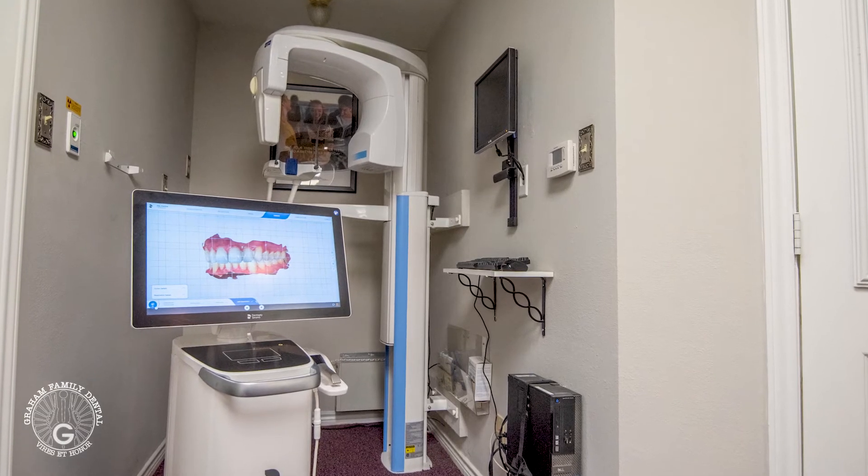It also lets me scan the relationship of the teeth and how they interact together, which gives me a chance to figure out articulation and how the crown needs to be shaped — not only when a patient closes, but also when their jaw moves as it does when you chew. When you chew, you don't just bite up and down straight; the jaw actually moves in more of a teardrop shape, which you have to take into consideration when designing the crown, which the PrimeScan allows me to do.